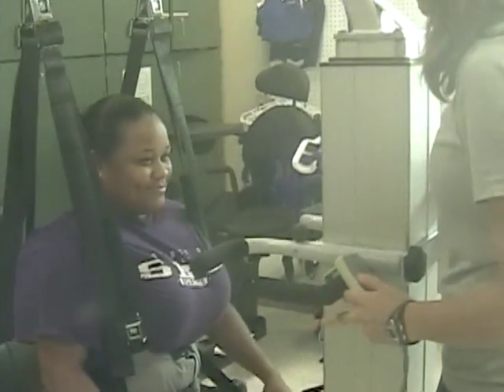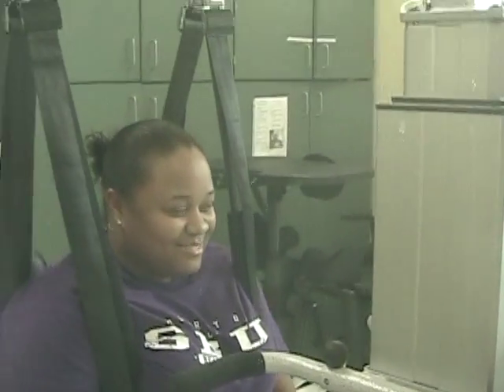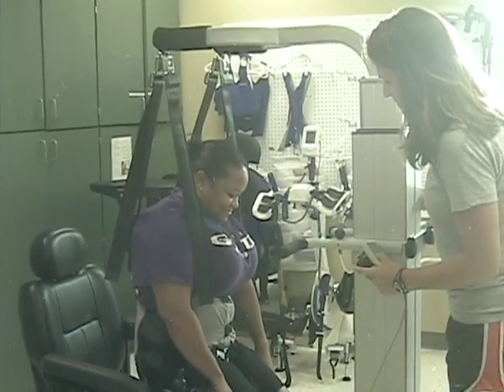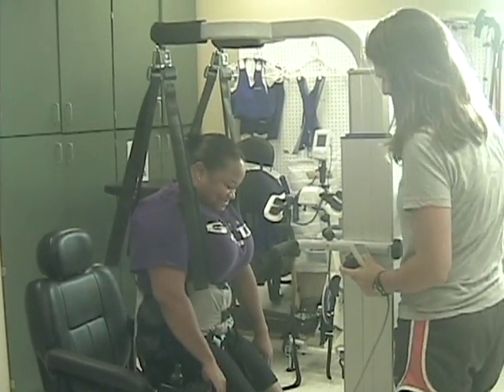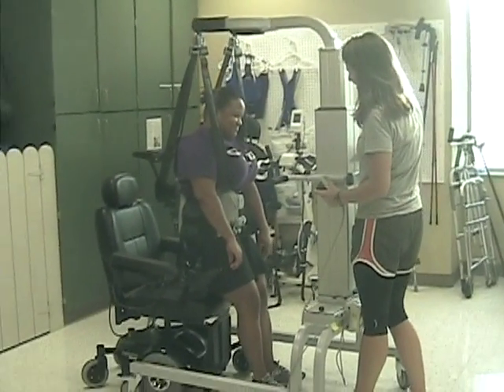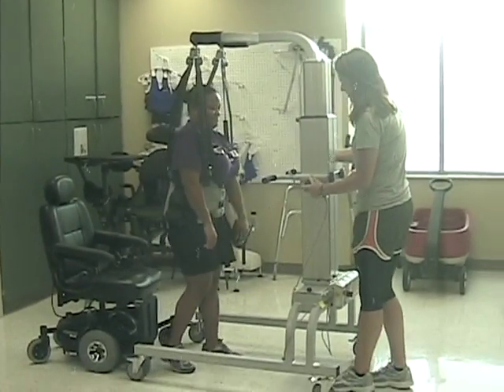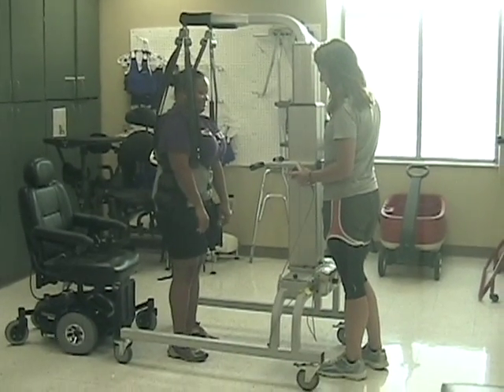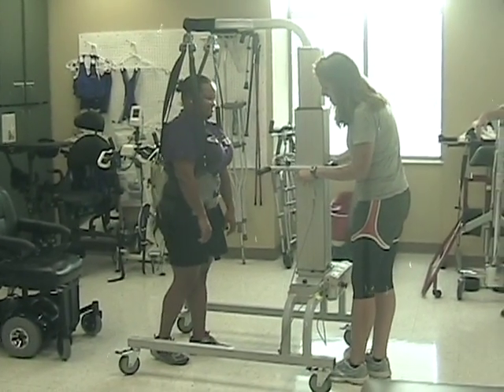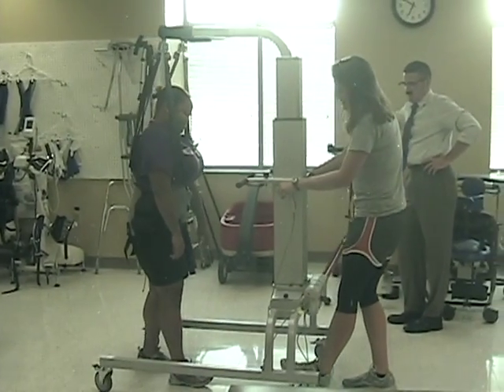Once in position, the patient can be assisted from sit to stand by the press of a button. Once in the standing position, continue to lift the patient until he or she reaches near the pain threshold. Once this position is obtained, simply guide the patient as they begin to walk. The wheels can be locked, which will allow the light gate and the patient to only move in straight lines. When the wheels are unlocked, the patient can initiate staggered stance and side-to-side movements.